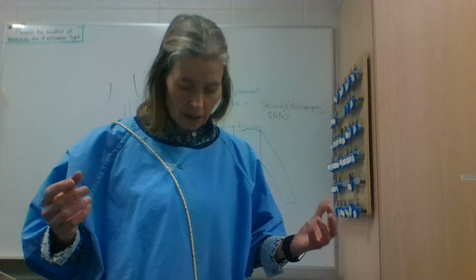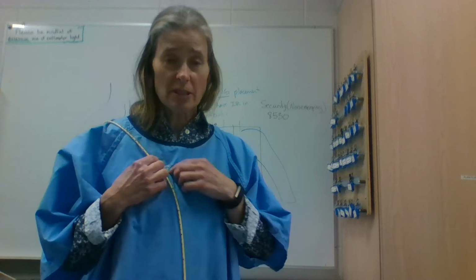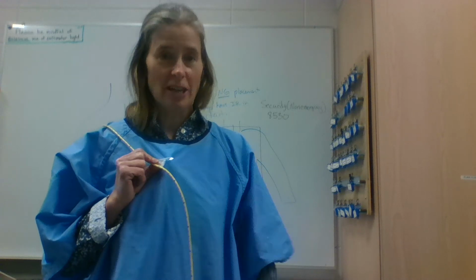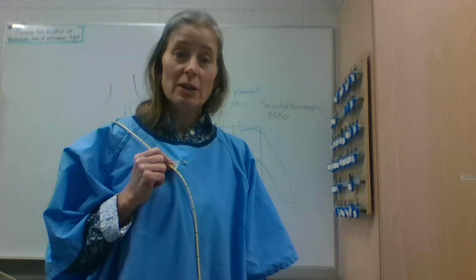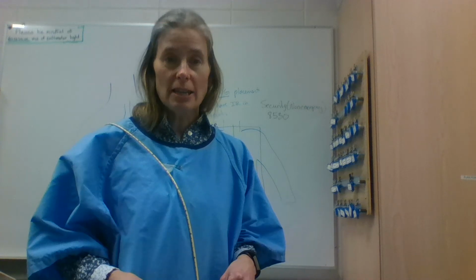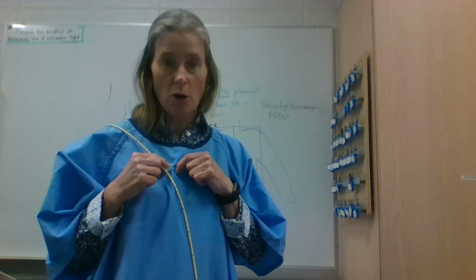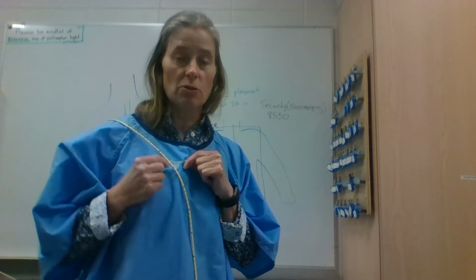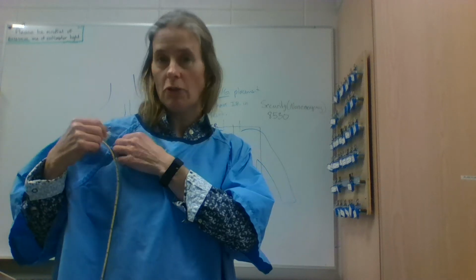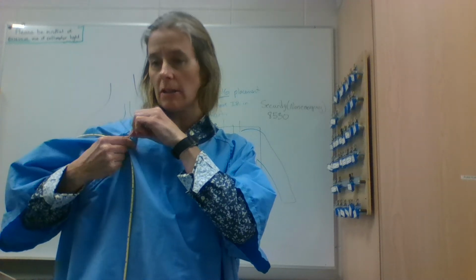Okay, so you're going to come across a patient who has an NG tube. They're basically going to be secured, if you want to call it that, to the patient's gown, and it'll just be by a bobby pin. So what tends to happen is that will cause artifact. When we take any kind of X-ray, if it's a chest X-ray and that bobby pin and perhaps the rest of the tubing is going to be in the way, we very gingerly and very carefully move that pin off to the side in the shoulder area so it's not going to be shown across the chest.